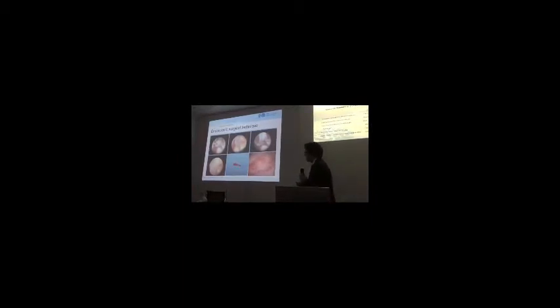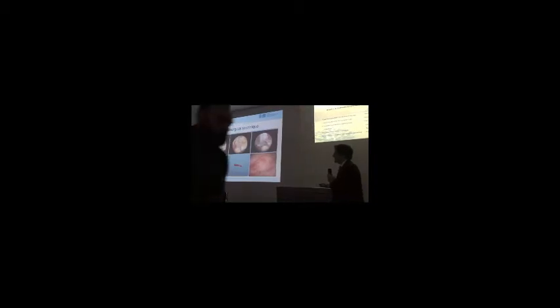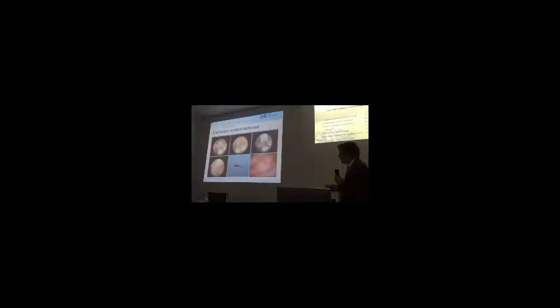You see that this colloid cyst really came out in toto, and this is then the roof of the third ventricle. Inspection with the 70 degree optics, you see that there's complete resection.